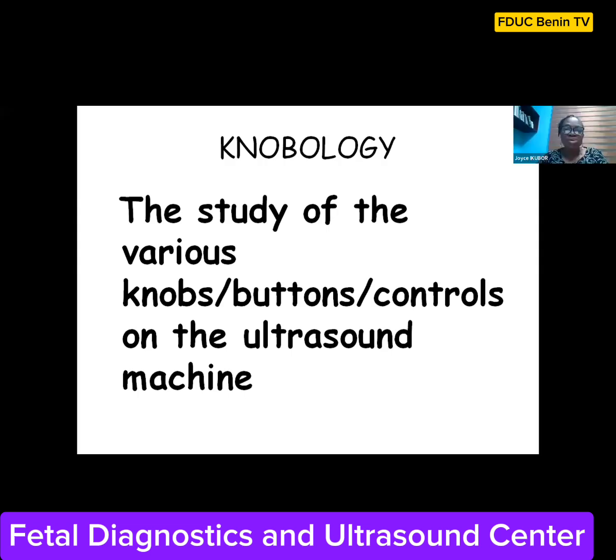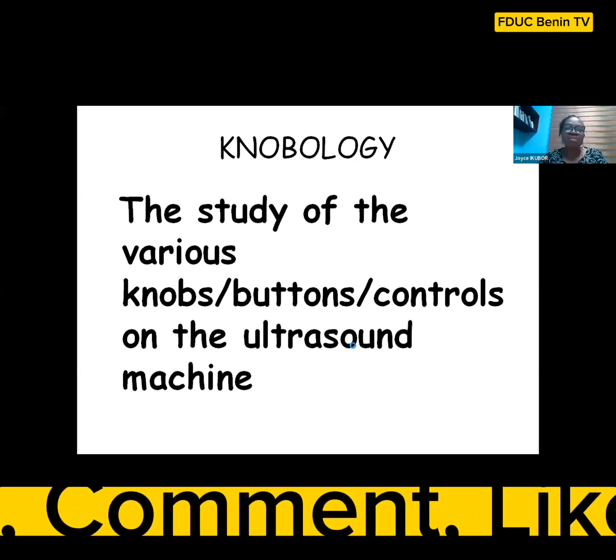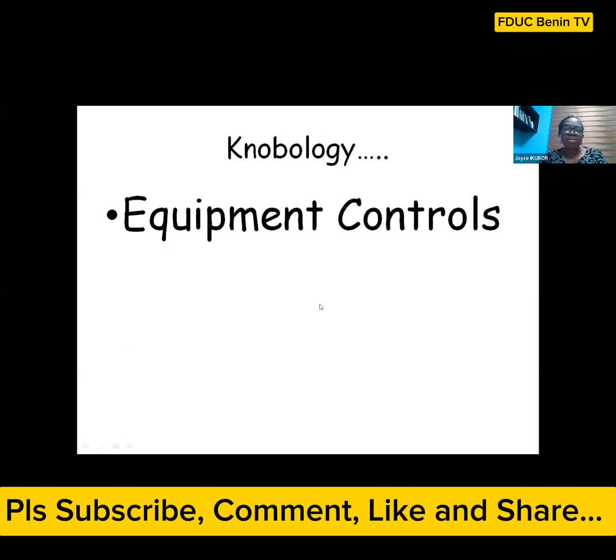So knobology is simply described as the study of the various knobs or buttons or controls on the ultrasound machine. Knobology can also be described as the equipment controls.